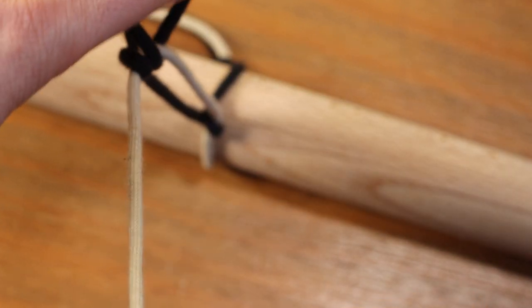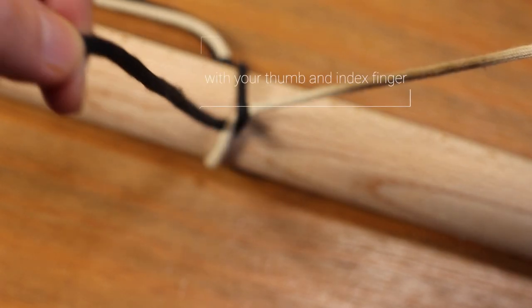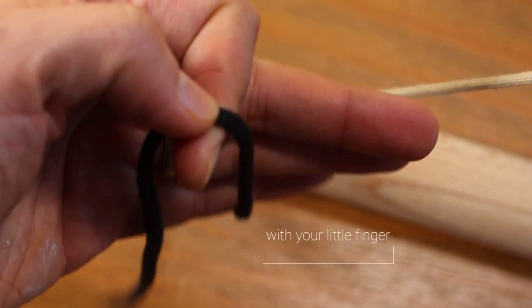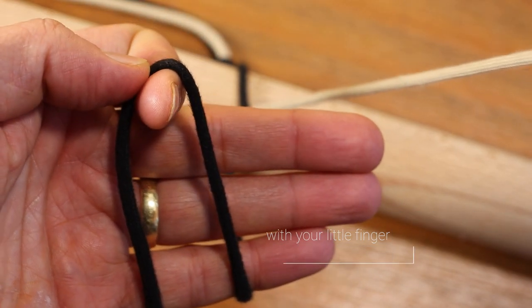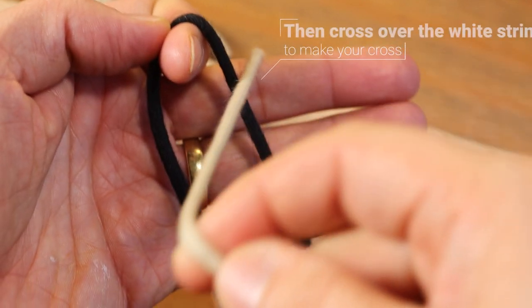Now as before, let's do that in slow motion so you can see it in more detail. So you can see here this time we're holding the black string between the thumb and the index finger. Now because we're coming down on top of the black string this time, we're going to use a karate chop action to pull that string taut. Now that we're in the right position, you can pull the white string over and make that cross that we made before.